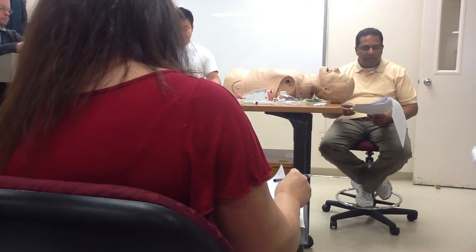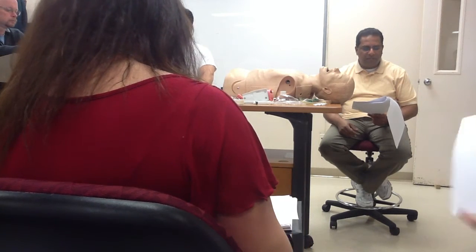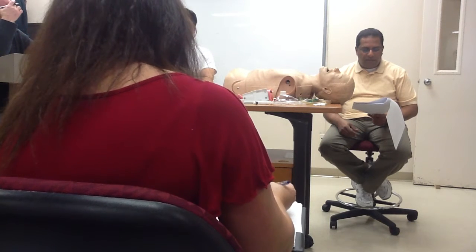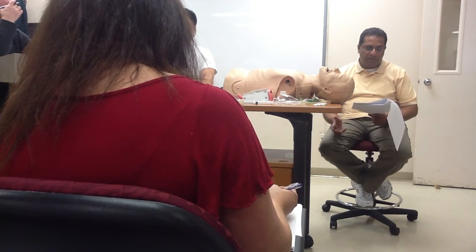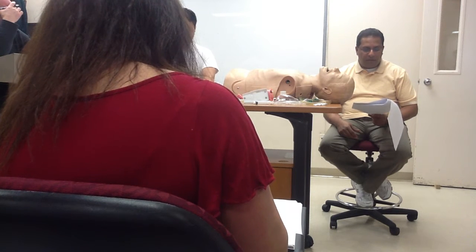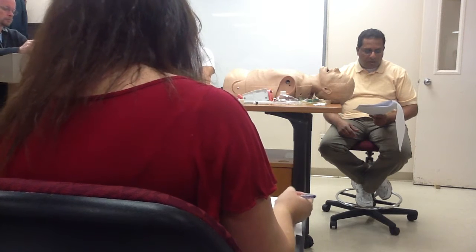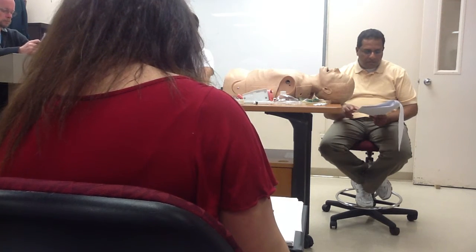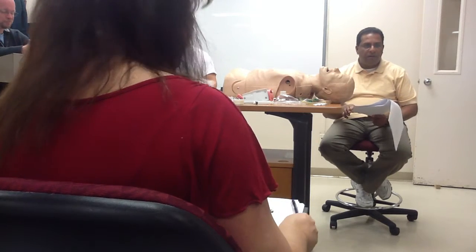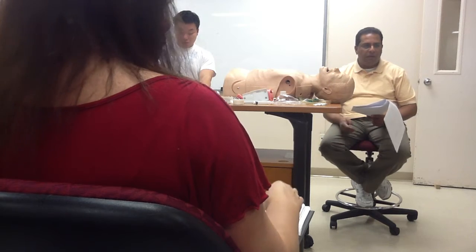Phase 3. ET tube sizes. So obviously they have different sizes of ET tube. Adult males usually have 8 to 9. We use 7 to 9. Adult females 7 to 8. And ET tube markings. Just read through that. Let me pass these around so y'all can see the markings that we're talking about.